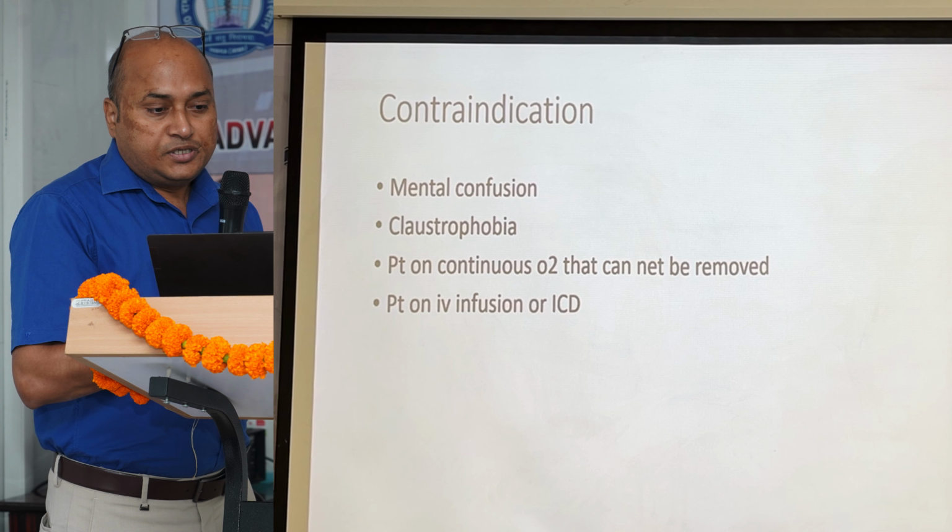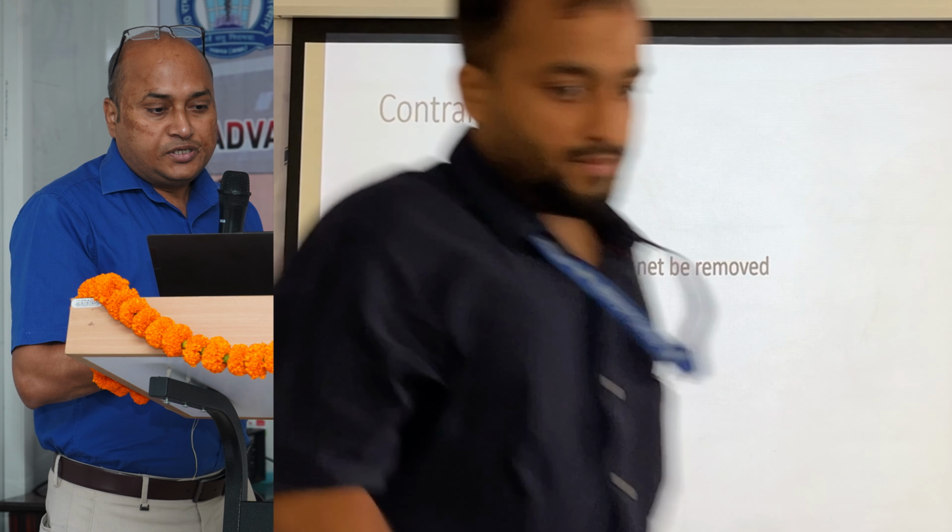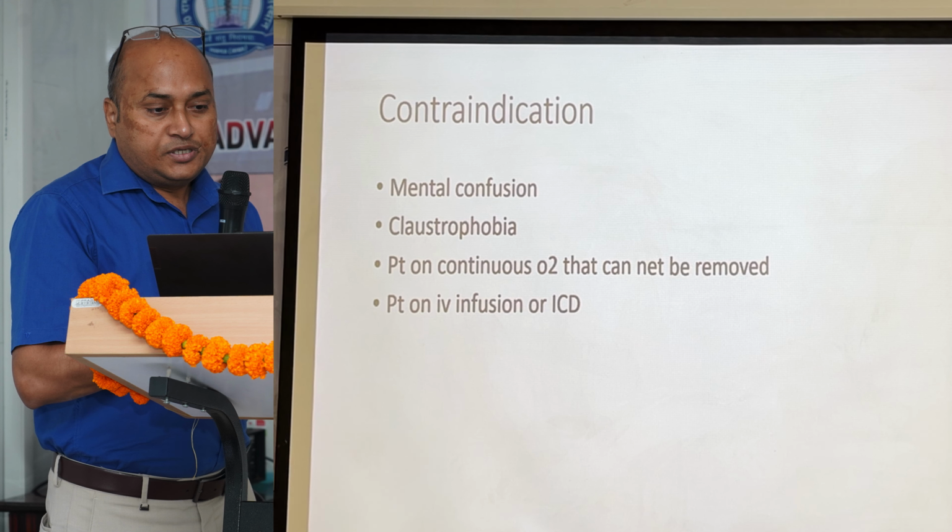Because, as we see, the body box is a box-like structure. Any patient who has a fear of closed spaces is a contraindication for putting the patient in the body box. Also, patients having mental confusion, patients on continuous oxygen, and patients with an IV infusion or intercostal drainage, where the closed chamber is not maintained.